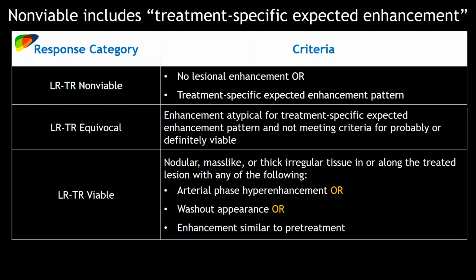I just have a comment. This is Claude. Forgive me, I don't know who it was who asked you to review that case, but I think he made a great observation, a great point, that strictly speaking, according to the treatment response algorithm in LI-RADS, if that had been an arterial phase, so it sounds like it was probably not an arterial phase, but let's just pretend it was an arterial phase, then strictly speaking, that should be equivocal as defined by LI-RADS.